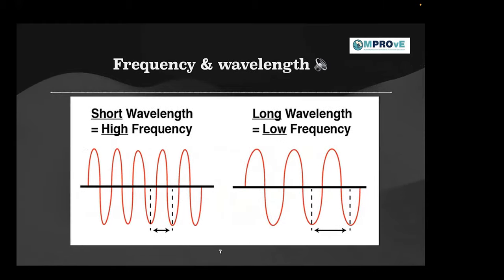So in terms of frequency, this is how I think about it: it is the number of ultrasound waves generated every second. Hertz is the unit of frequency. If you have a higher frequency, that means you are generating a larger number of ultrasonic waves. The time between consecutive waves will be much less compared to low frequency, where a low number of waves are generated. So the time gap between the two waves will be higher. This is what is depicted here.